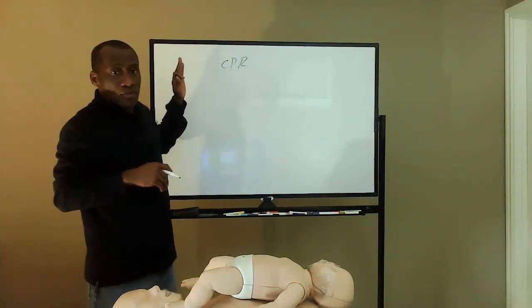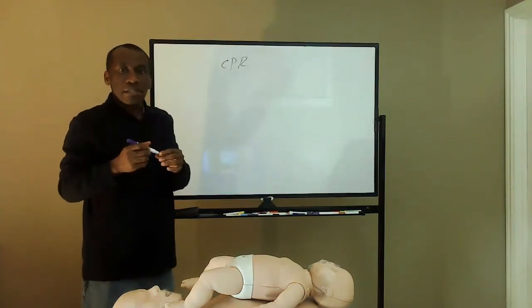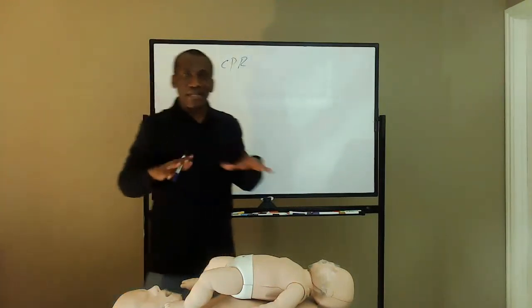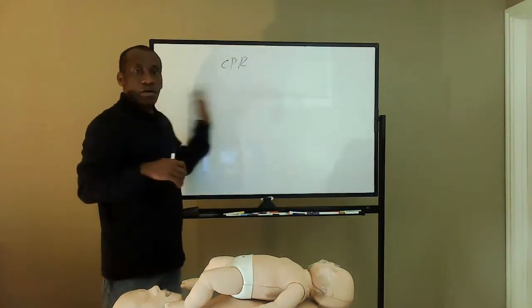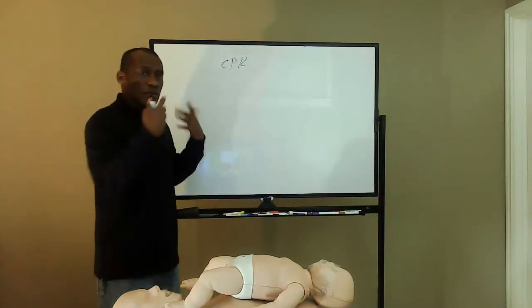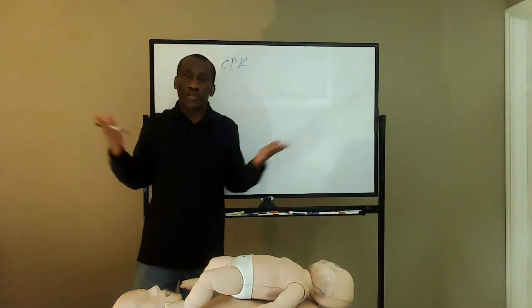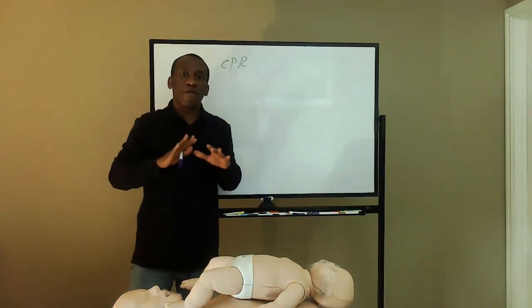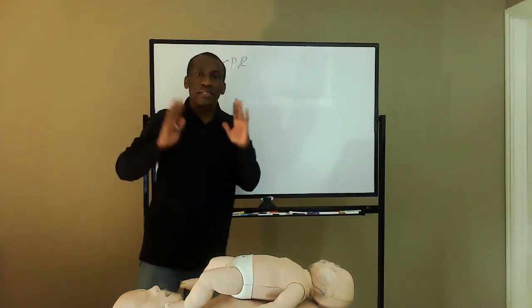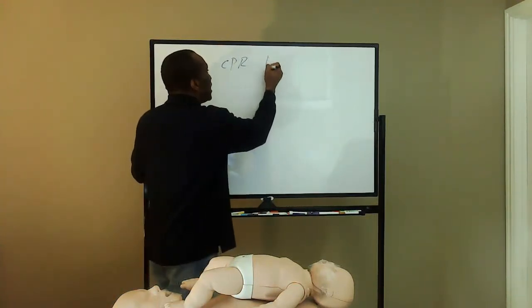So let's assume somebody is in cardiac arrest. The person who is about to help, the person who is resuscitating, has already called the emergency number, 911 or your local emergency number. And then one of the things you should request, even before you start performing CPR, is an AED. So you need an AED in this situation. Apart from CPR, you need an AED.